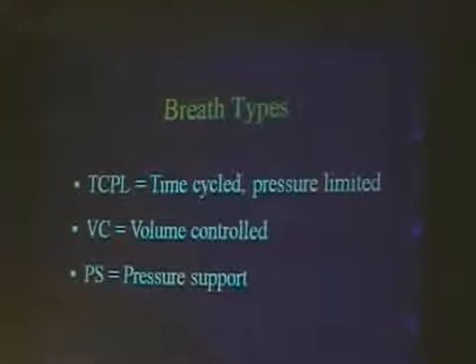And everybody says, oh, it's all the same. Well, it's not quite. It depends on when you flow cycle that breath off, all right? So for practical purposes, everybody just needs to understand that when you're on assist control, you need to make sure that breath is allowed to terminate sooner, because the baby may be breathing very fast, and if you've set an inspiratory time that's too long, then that can be very stressful for the baby, because he's trying to breathe out while the ventilator's trying to hold the breath, all right?